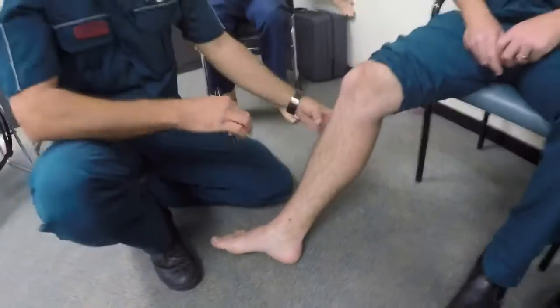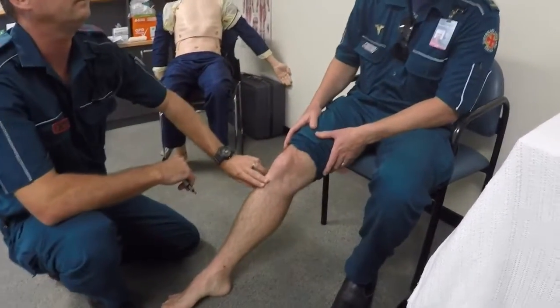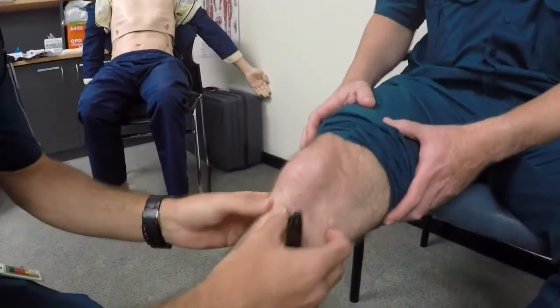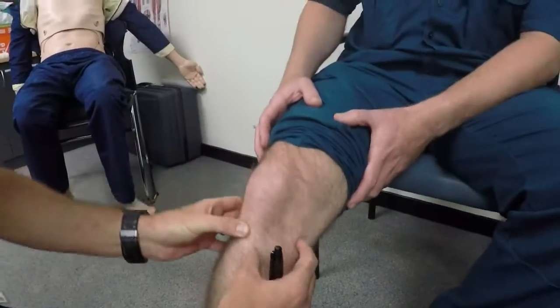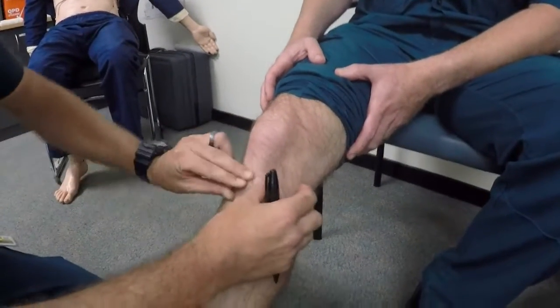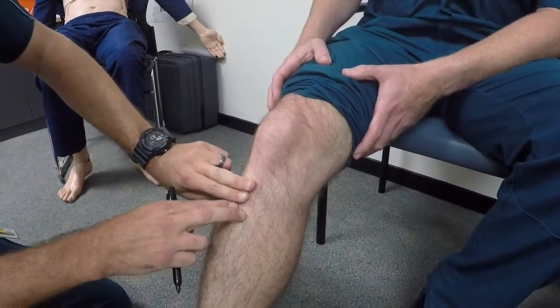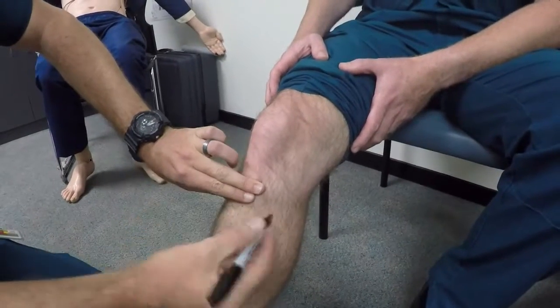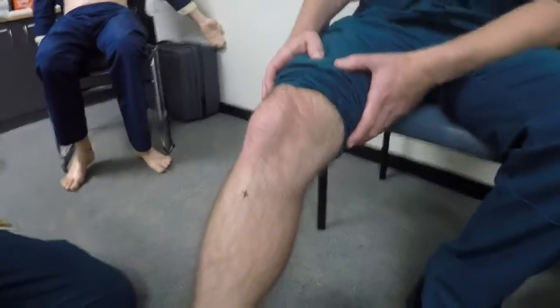There. In terms of our proximal tibia, we would find the tibial tuberosity, which is a bony prominence just below the patella, which can be palpated in this patient approximately 2 centimetres below the patella. The insertion site is 2 centimetres distal and medial to the tibial tuberosity, so approximately there.